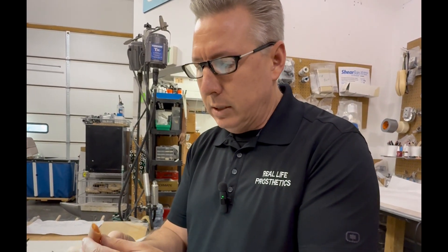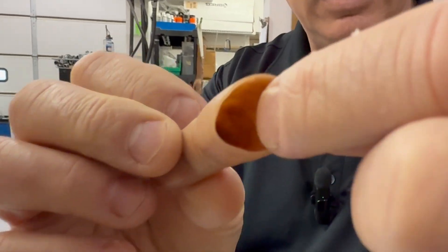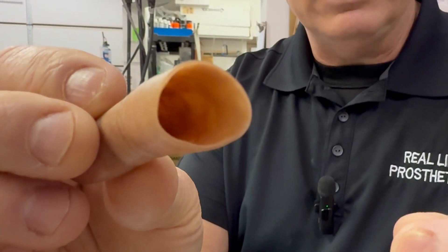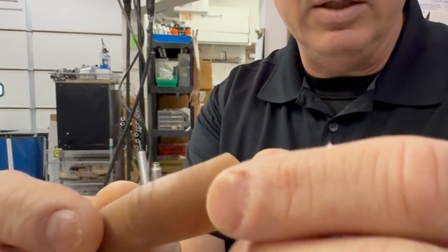As far as this finger, everything looks good around the edges. We can see nice feathering and tapering transitioning from the socket back into the body. Everything looks good there.